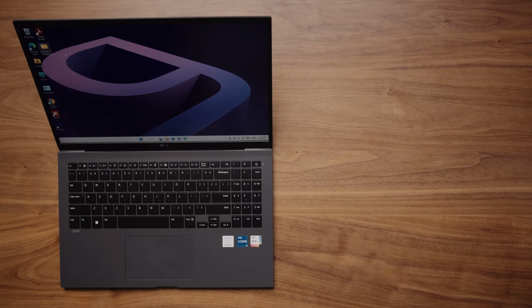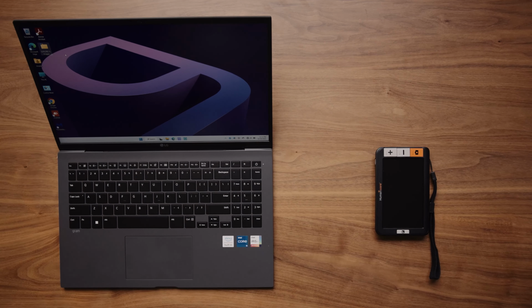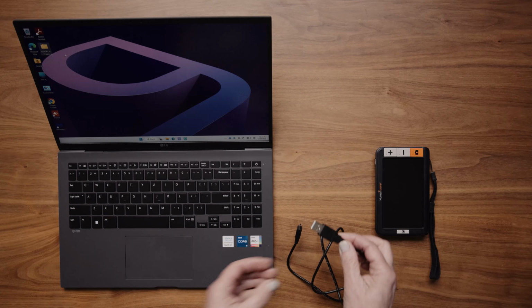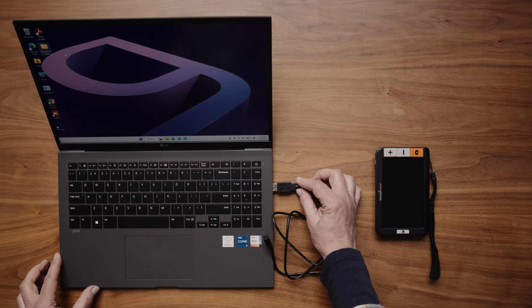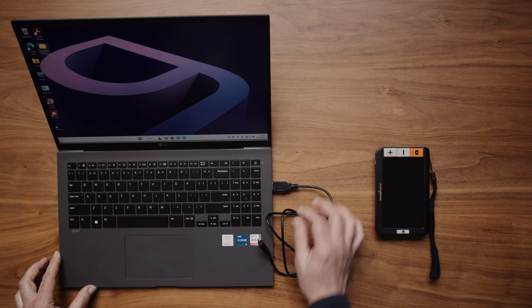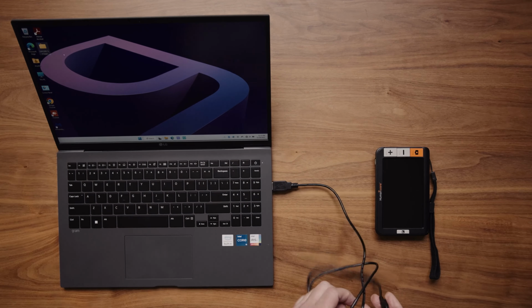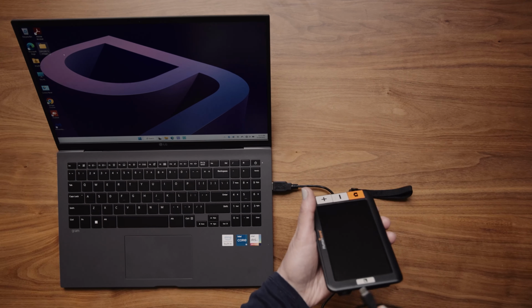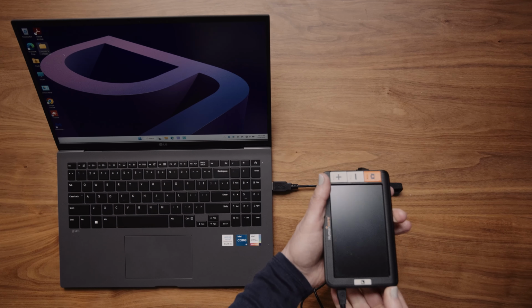Copy or move saved images to a computer. 1. Use the USB cable to connect the Explorer 5 to a computer. Plug the larger side of the USB cable into the computer with the tactile USB symbol face up. Then insert the micro USB connector into the Explorer 5. The single bump on the micro USB connector must face up.